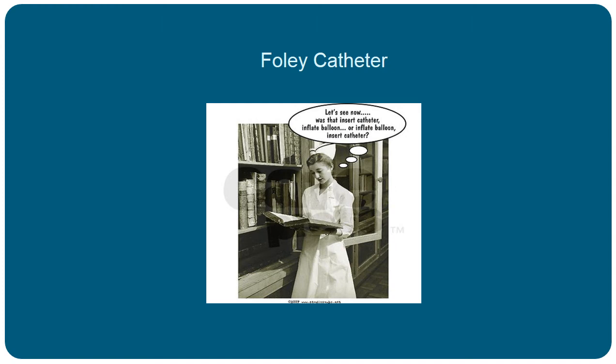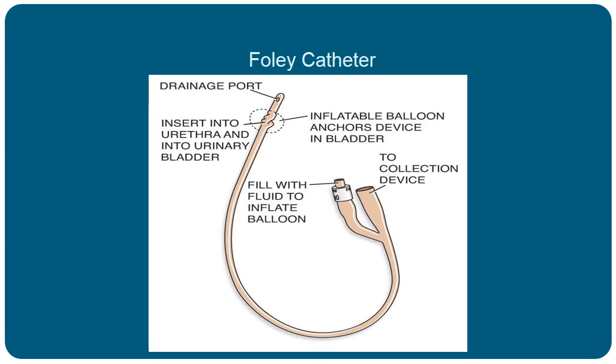Knowing the parts of the Foley is equally as important. You have the drainage port, which is where urine enters into the Foley to be excreted. The inflatable balloon that keeps the Foley in place. The urine collection device, which allows the urine to enter into the Foley bag. And the fluid filling port that allows the balloon to inflate.